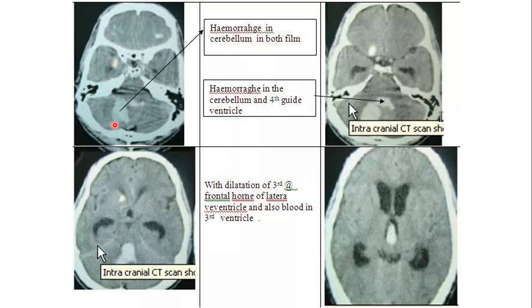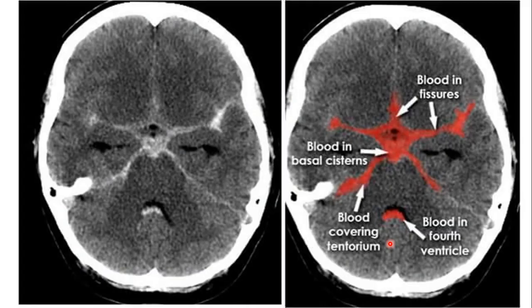Another example of hematoma with ventricular extension: bleeding within the right cerebellar hemisphere extending into the fourth ventricle, resulting in dilatation of the temporal horns of the lateral ventricle indicating hydrocephalus due to obstruction. Blood is also seen in the third ventricle, in the fissures, along the prepontine cistern, ambient cistern, and fourth ventricle.